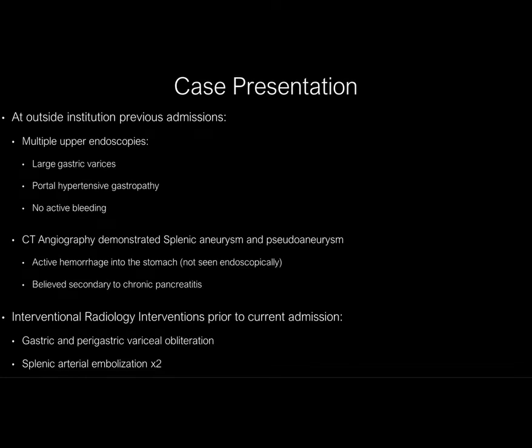At the outside institution, she had previously undergone multiple upper endoscopies, notable for large gastric and esophageal varices, portal hypertensive gastropathy, but no active intraluminal bleeding was noted.